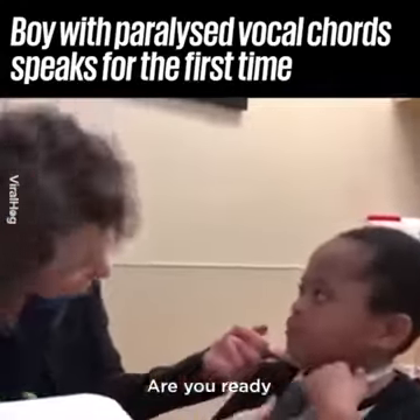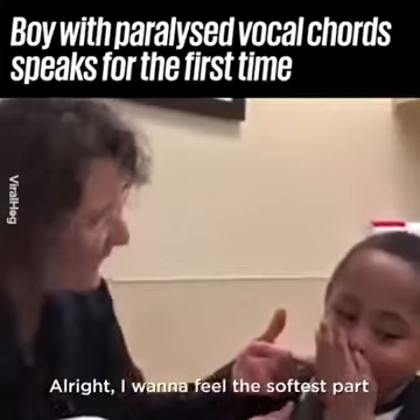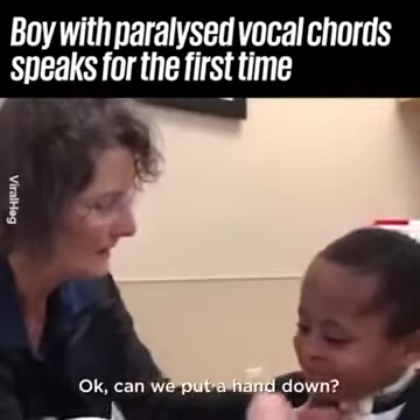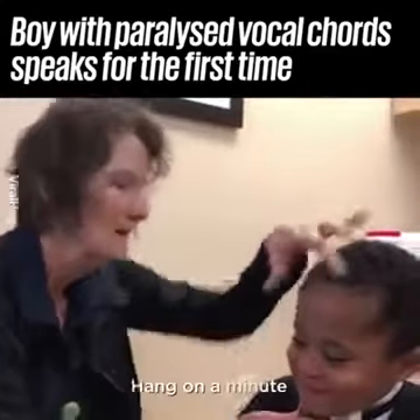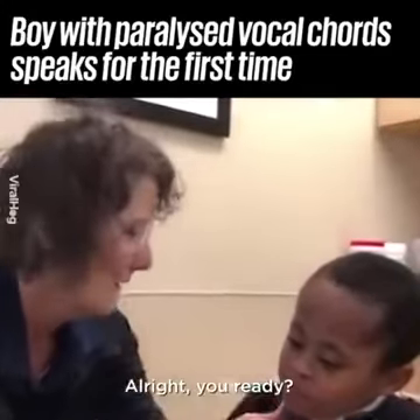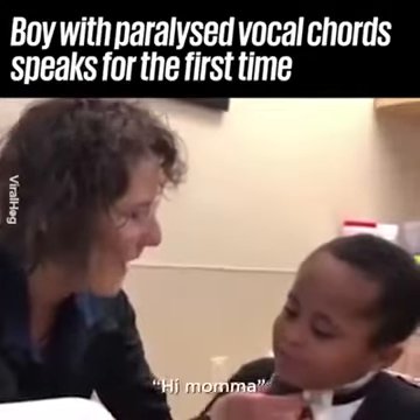Are you ready? Let me find the softest part. Put a hand down — all right, hang on. You got it. Okay, I'm gonna turn it on — you say hi mama.